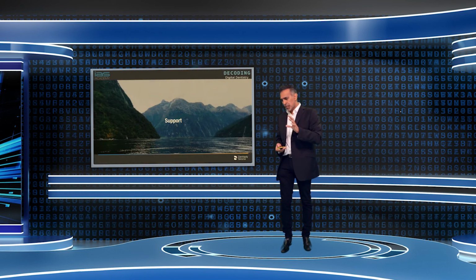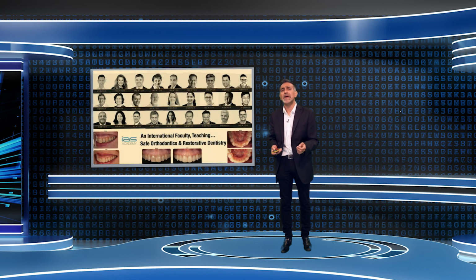So, super important if you ever take on this sort of treatment is to have support. If you're going to get into learning how to do aligners, we need to understand what we're doing, how we do it, and actually to perhaps have your hand held. If you've not done aligners before, it's important.